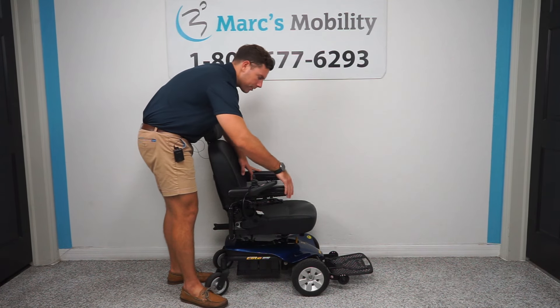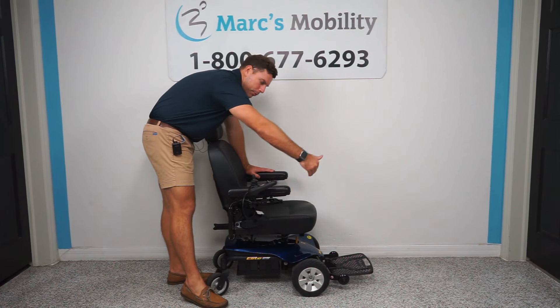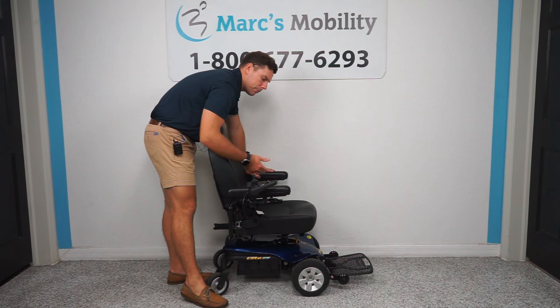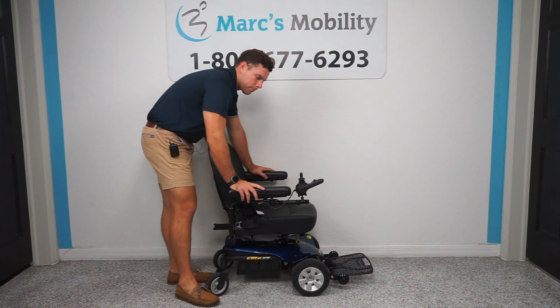The armrests can flip up on both sides, and this one has a right-hand swing-away joystick. You can see how the joystick swings all the way to the side of the arm so that you're flush with the end of the armrest, allowing you to pull up to a table or enter and exit the chair without worrying about pushing the joystick.